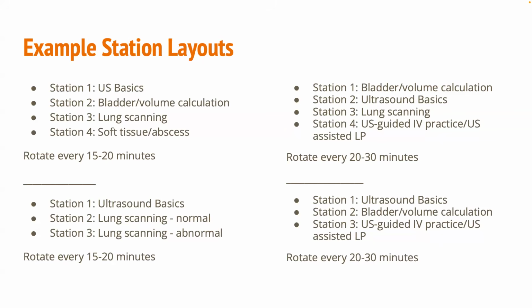And then I have a picture as an answer key to show what it's supposed to look like. And so it's a more basic way to drive home those points of, well, if you fan this way or you rotate the probe 90 degrees, you're better able to see XYZ. And so that helps them with that concept a little bit better, especially if you don't have any of those fancy sim machines that show you the exact visualization of how the probe works. Not all of us have that.